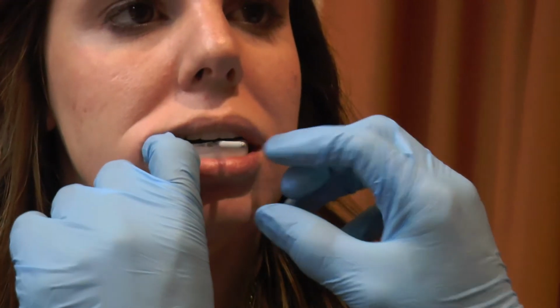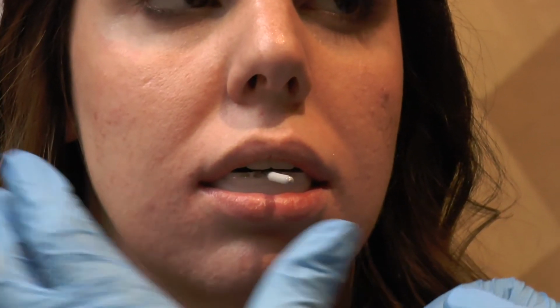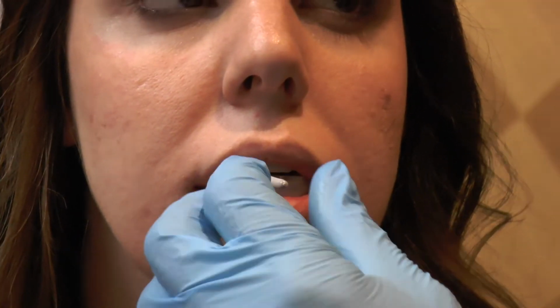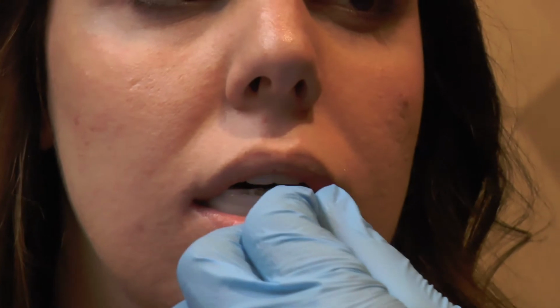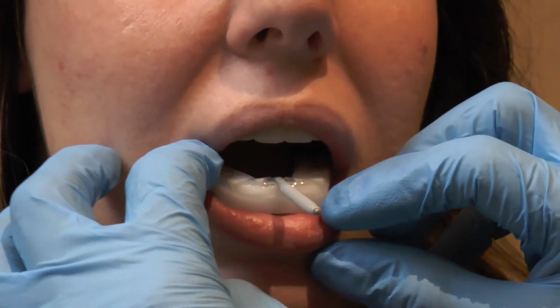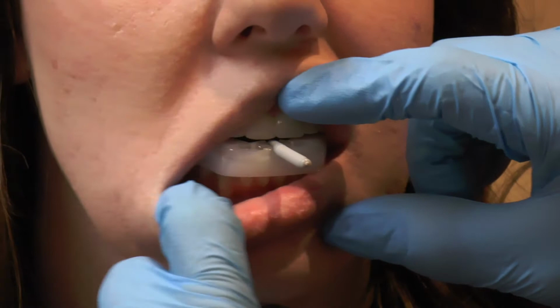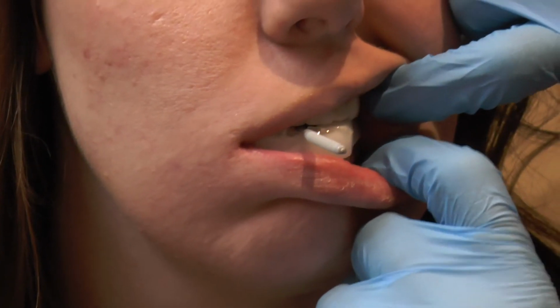So go ahead and close down for me. What you'll see is you keep the shaft aligned with the nose as we did with the beak. So when we put the two components together, we won't have the lower jaw being pulled to one side excessively more than the other and be very much in close proximity. There's a little bit of a buffer built in, so if you're slightly off, there's a little bit of flexibility in this rod to make up that difference. So the first thing, stay close to me, dear, thank you, is once again, you want to make sure that the tray covers the teeth, as you can see here.